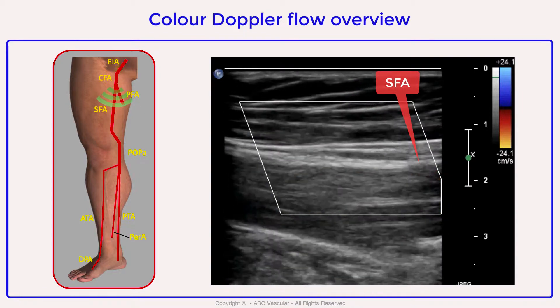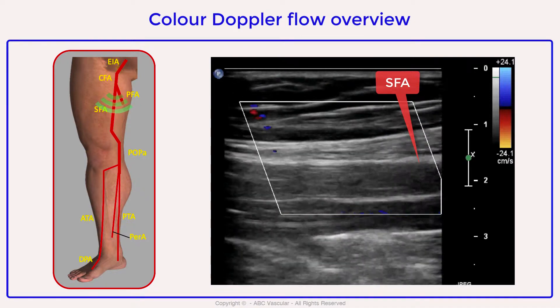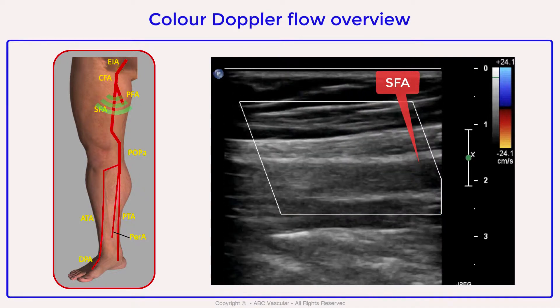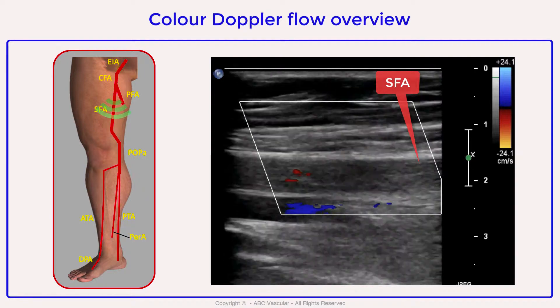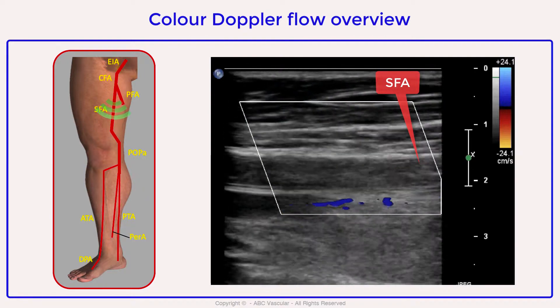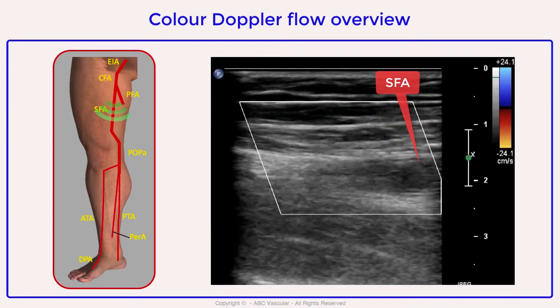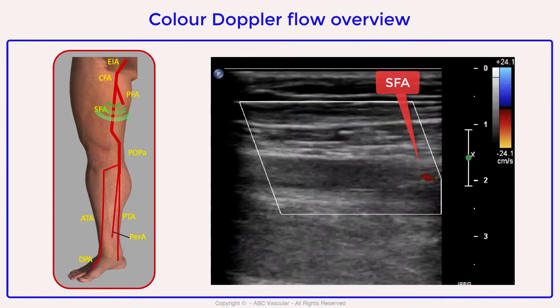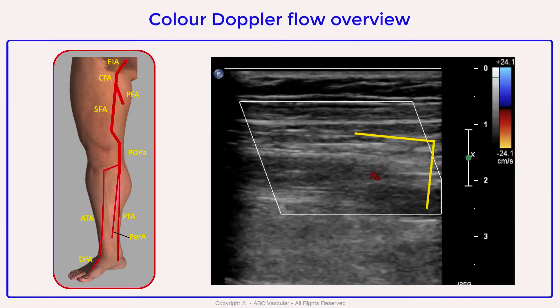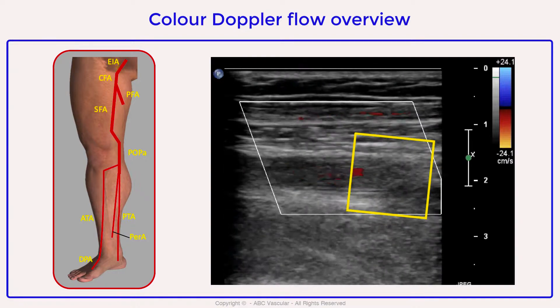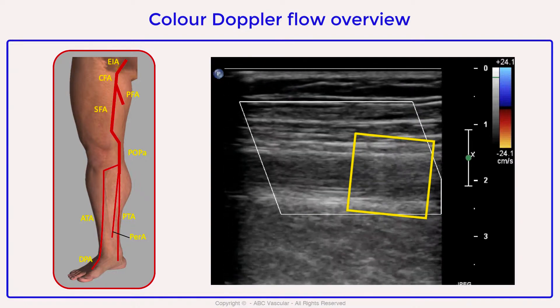As we move the transducer down towards the mid segment of the superficial femoral artery, we can see that there is reduced color filling. This is due to the presence of the segmental occlusion at the level of the mid thigh. The occlusion appears as an absence of color Doppler flow filling the lumen of the arterial segment.